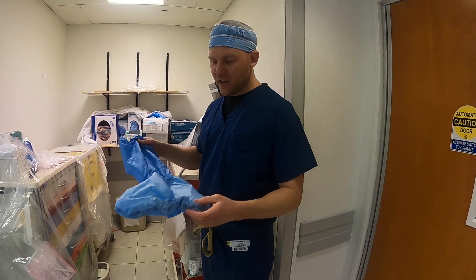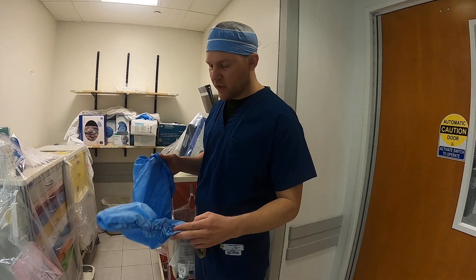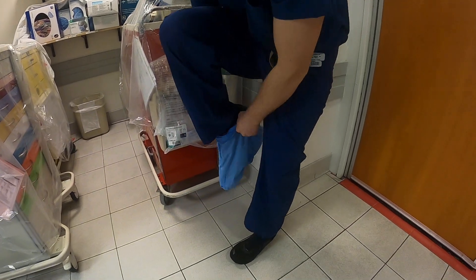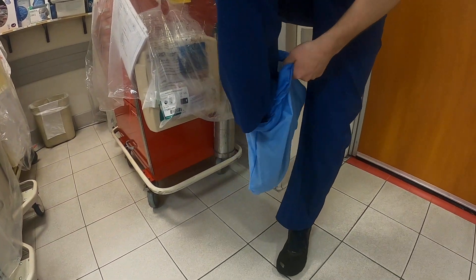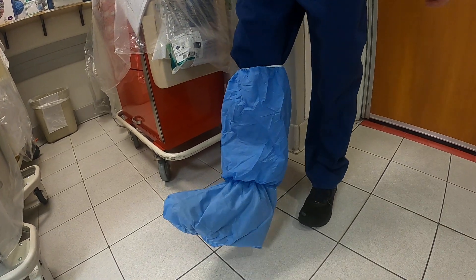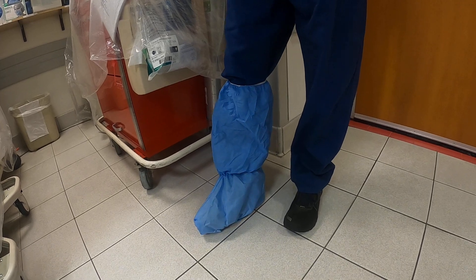If you have a bloody amputation or an arthroscopic case, you may want more shoe cover protection. The boot-style shoe cover looks like the shape of a boot. Slide it on — it's a little harder to get over your heel — then pull it up kind of like you're putting on a little pant, and this will keep you protected if there's going to be a lot more fluid during the case.